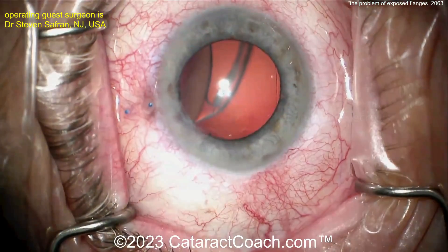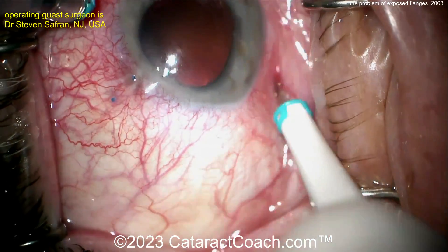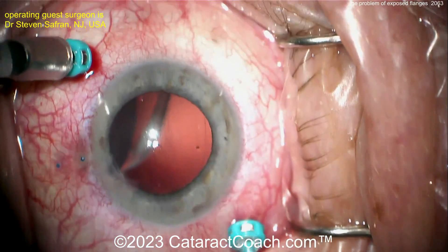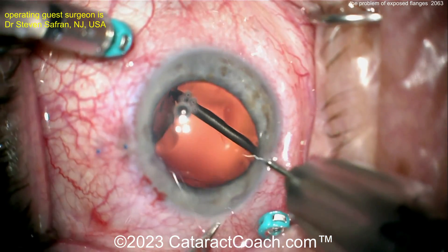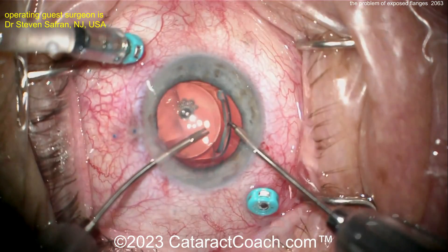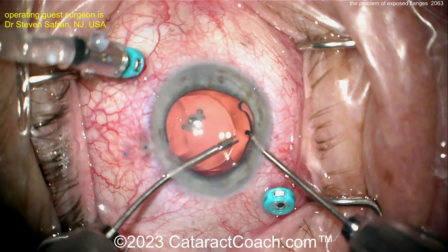So this is a problem. Here's the patient now on the operating room table. You can see pars plana infusion lines going inside, and that lens is really dangling back. The patient needs a good thorough vitrectomy as well, and grabbing that lens, bringing it up — very carefully bringing that existing lens up here. That's going to have to be explanted.